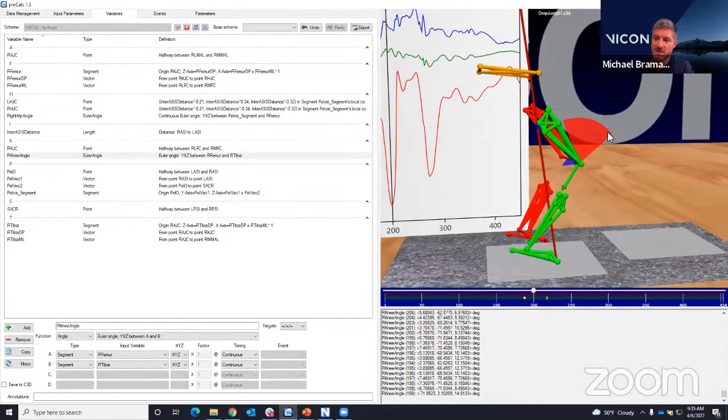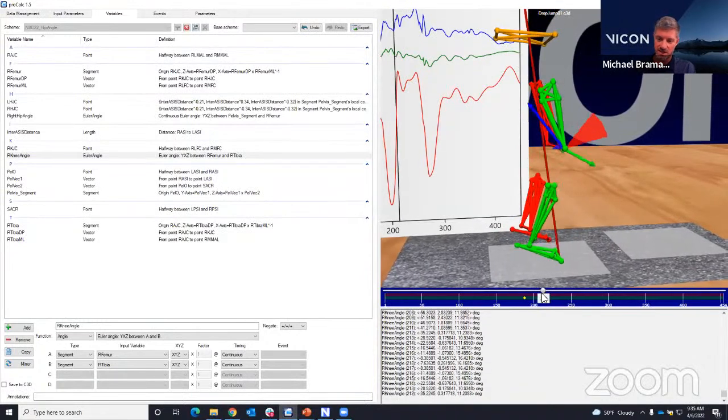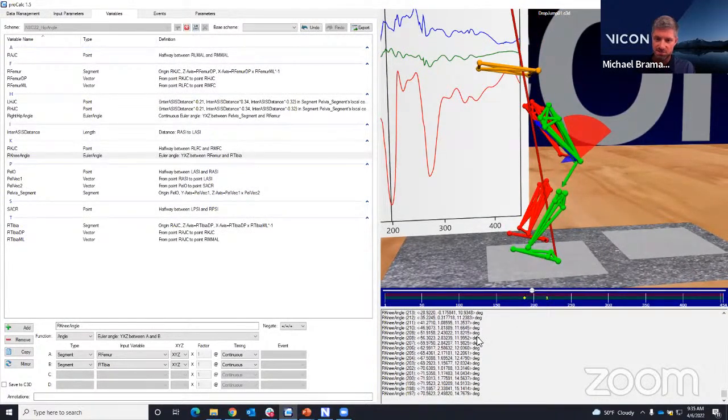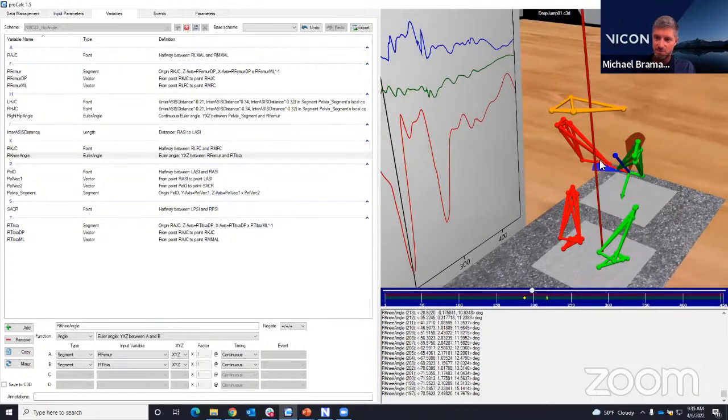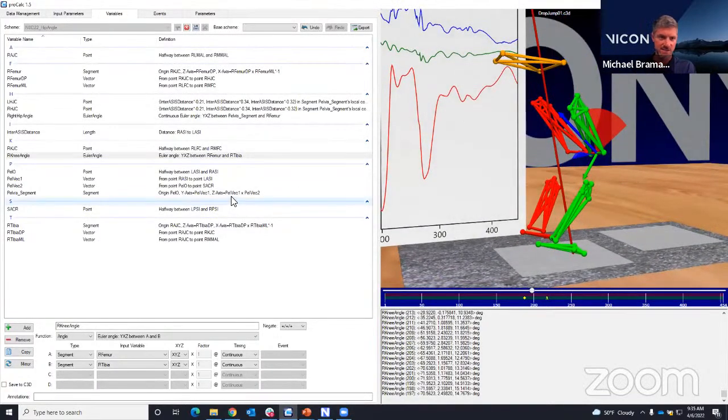It's great, as I mentioned, that we have visualizations the entire time. I can see these outputs below, the three components. That red one is again our flexion, our primary axis of rotation. You can see how it changes as we scrub through, and you can see the values change. The blue one is our rotation value, and the Y one, which is really small, is the varus valgus within the knee.